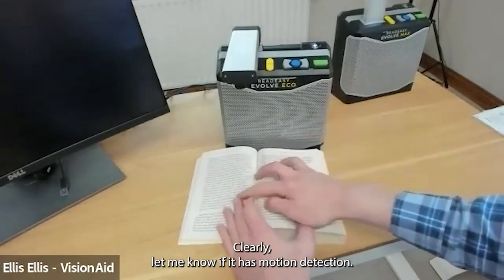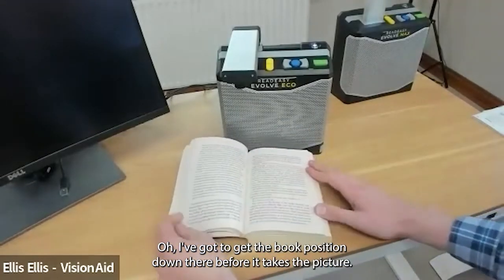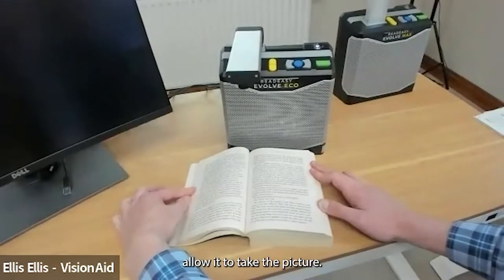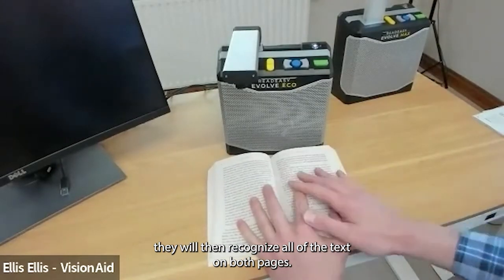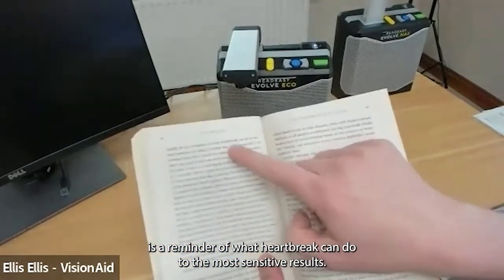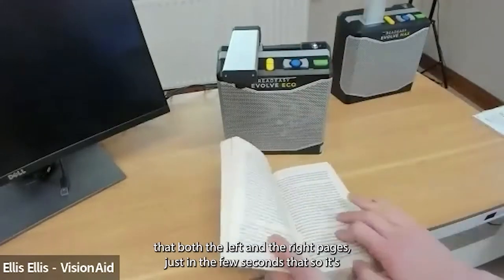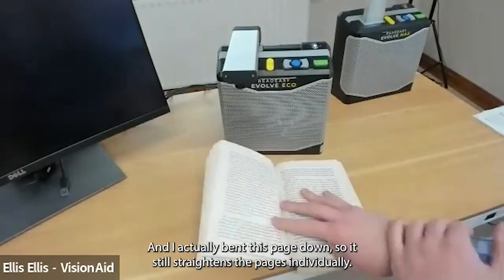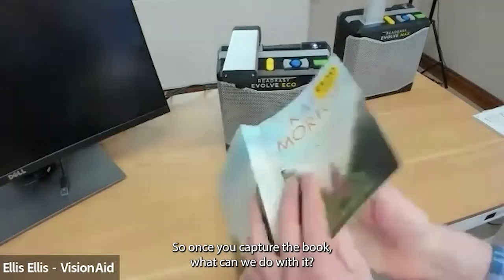It has motion detection, so there's no rush to get the book positioned before it takes the picture — take as long as needed to get your hands in the right position, and when you hold them still it takes the picture automatically. It then recognizes all the text on both pages. The device reads: 'Kate Morton... these are a reminder of what heartbreak can do to the most sensitive...' It's done both the left and right pages in just a few seconds, and it still straightens even a bent page.